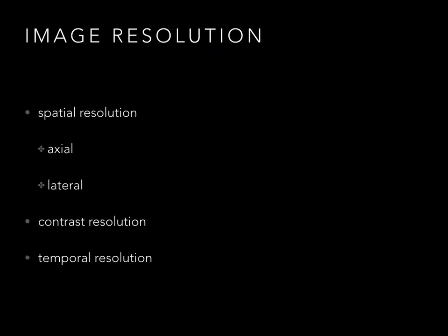When we discuss image optimization, we have to consider several factors. Image resolution is the ability of the machine to differentiate two objects and then display them as separate, and can be defined in terms of spatial, contrast, and temporal resolution. Spatial resolution refers to the ability of the ultrasound machine to detect structures that are anatomically separate and to display them as being separate.